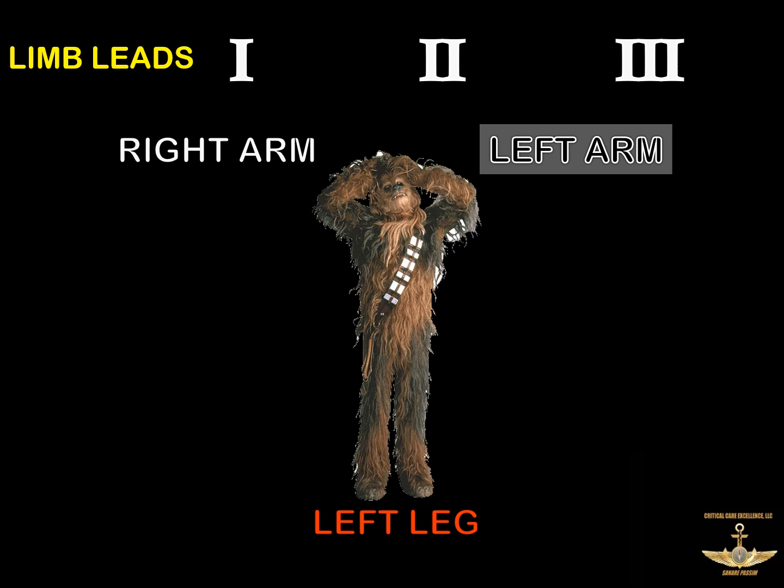As a matter of trivia, if you reverse the right arm and left arm electrode, that's going to cause serious problems in your EKG. It's going to essentially reverse the limb leads, and it's going to look terrible. But if you reverse the left leg and the right leg electrode, the machine doesn't know the difference. You'll never see that. Now, I'm not telling you to do that. I'm just telling you that the machine's not going to kick up a fuss the way it would if you reverse the right arm and left arm.